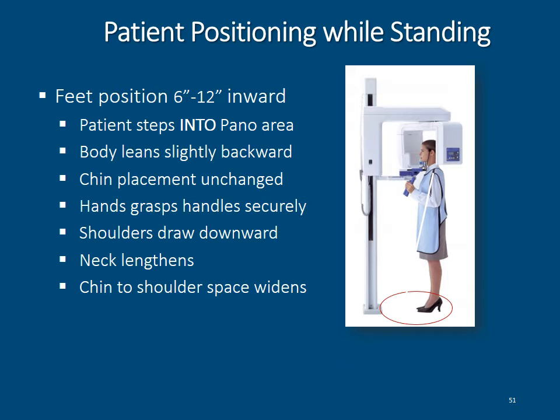Not all patients, especially the elderly, will be able to maintain this, but it is something to try and think about and encourage, so that way we can get head and neck alignment properly positioned.